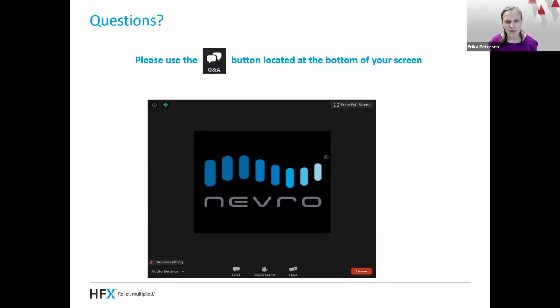You can turn the stimulator off at any point and just do a body survey and say, am I feeling my regular old pain, or is this something different? And that's another way to check in. I've had a few people turn their device off and go, oh yeah, there's the old familiar pain, and turn that stimulator back on again.